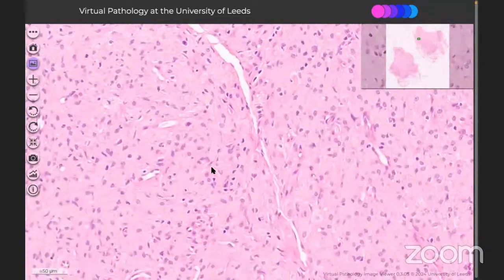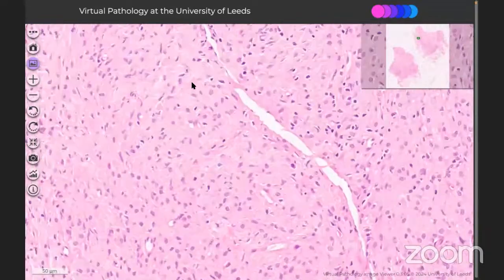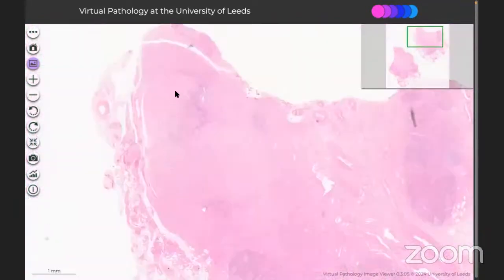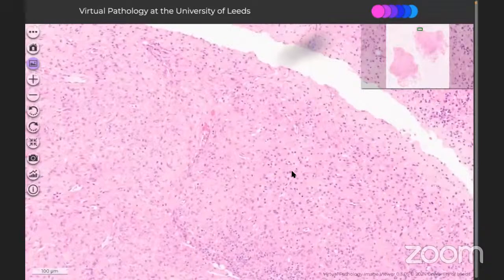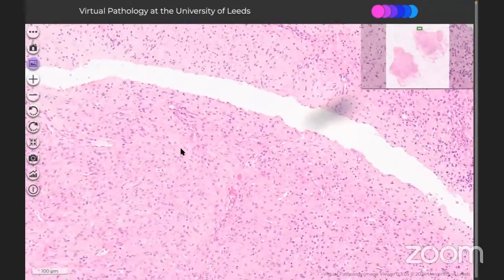So that is a clue to some kind of intracellular pathogen. With a history of intravenous drug abuse, in a young male of 40 years, you should keep in mind any immunodeficiency and associated infection.